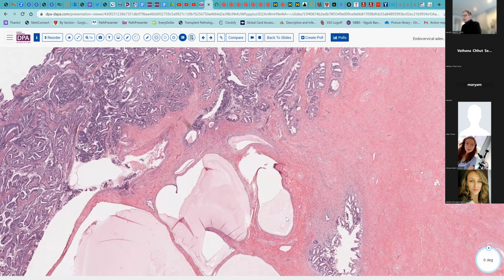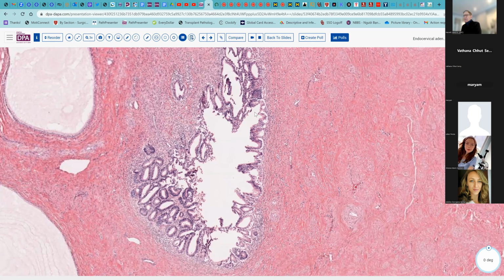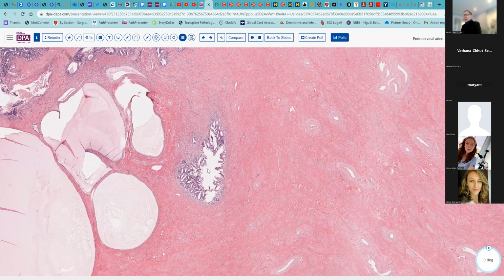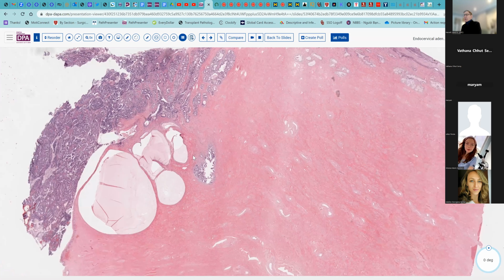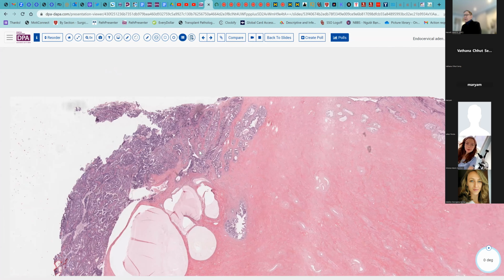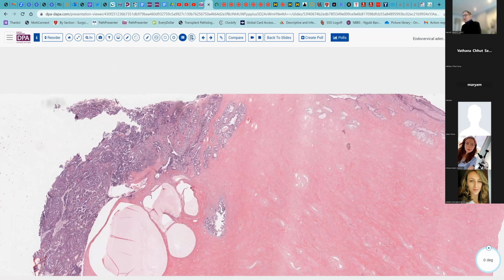And then here also sort of continuing at that level, we see this glandular proliferation. So it's difficult here to know, is this invasive tumor, or is this just sort of a complex gland within a pre-existing gland? And because of that reason, sometimes with this tumor, if you believe it's invasion, but you're not totally clear exactly where invasion begins and ends, we would report the overall thickness of the lesion rather than a depth of invasion per se, because it can be quite difficult to ascertain.